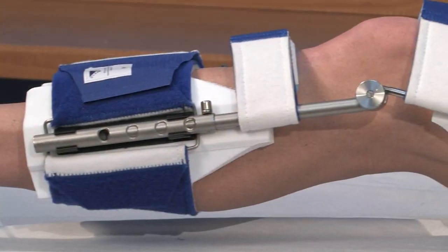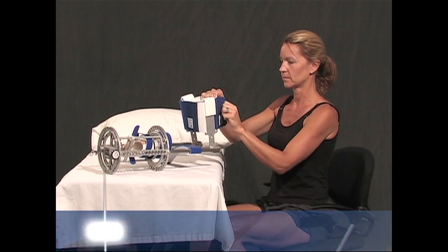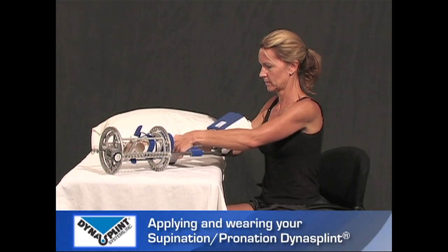Welcome to DynaSplint. Congratulations, and thank you for choosing us to help you restore your range of motion. We hope you find these videos helpful and easy to follow. Please refer to the labeling, tension setting, and positioning your DynaSplint consultant set for you on your initial fitting. Thank you, and we hope to stretch beyond your expectations.